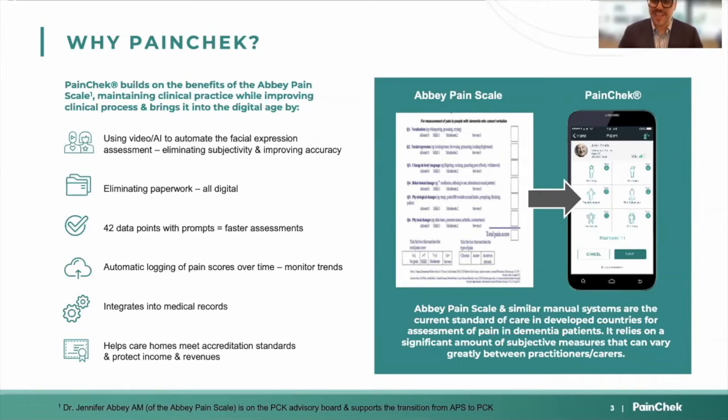This lets us leverage modern technology to go along with that modern redeveloped pain assessment framework. Our very first domain is assessment of the face using an artificial intelligence or AI tool. As I was mentioning, in terms of objectivity, no matter who's conducting that assessment, we're going to be getting a consistent and objective measure of the face because it's being mediated by an artificial intelligence system.